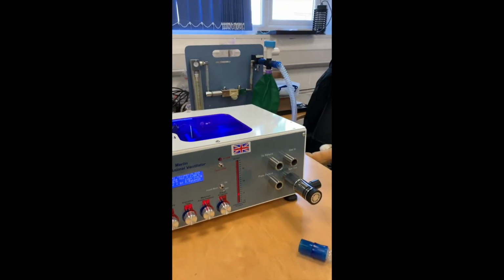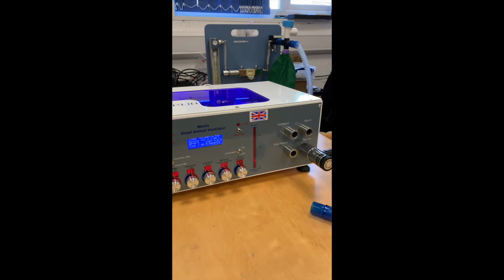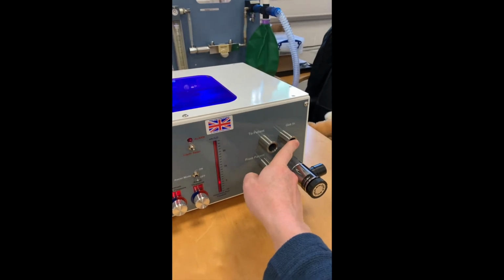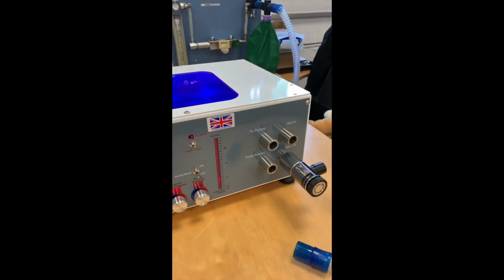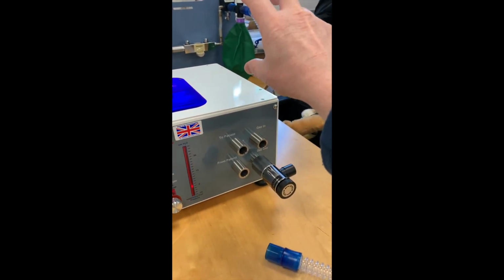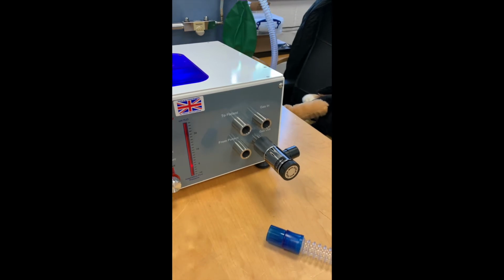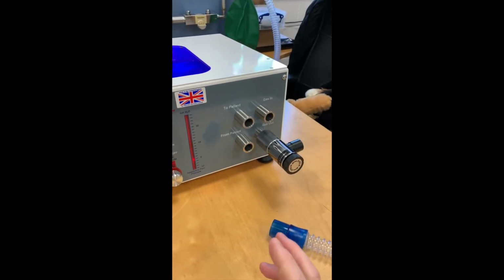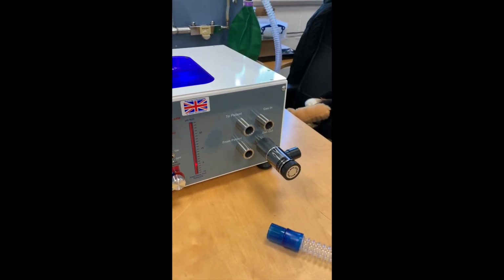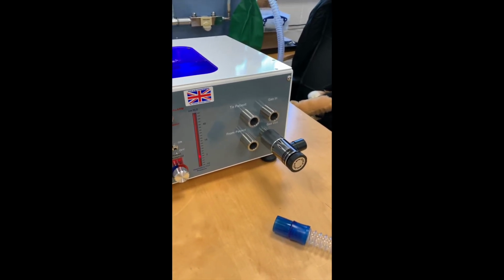What is the bag for on the anaesthesia machine? The bag there is to act as a reservoir for incoming gases and to make the use of Merlin fresh gas efficient. The gas input here is periodically closed during the inspiratory phase so that any incoming gas cannot enter the machine. During that period, the gas will collect into the reservoir bag and Merlin will use that to refill in the next expiratory phase when it's filling the piston again. What this means is that Merlin can actually exactly match the fresh gas flow requirement to its own minute volume requirement. And when the two are matched, that's the perfect efficiency for running a non-rebreathing circuit.